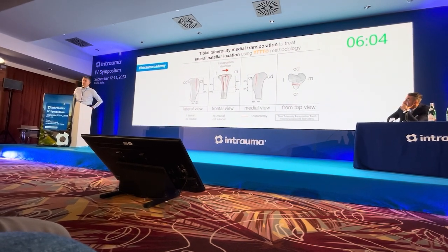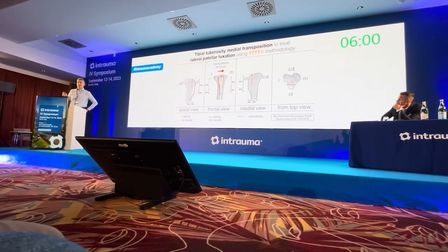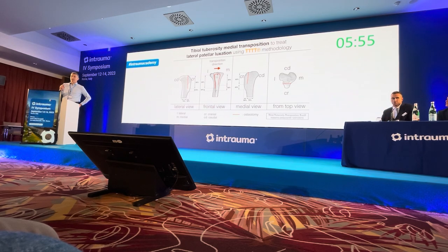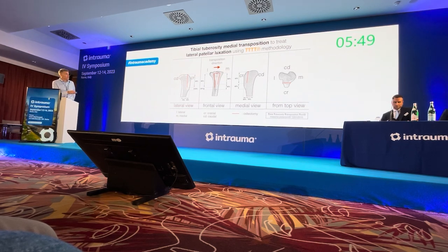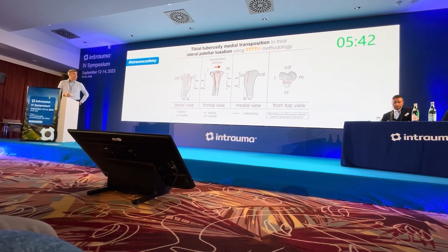So most importantly, what is new is the tool to streamline the surgical procedure. What is the same is the methodology and the principles behind it. So those of you familiar with the original TTTT, we're using the same methodology of an incomplete and oblique osteotomy. The tool is simply applied in a different fashion.